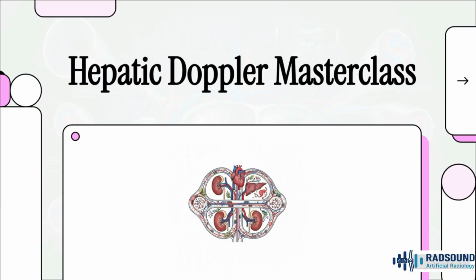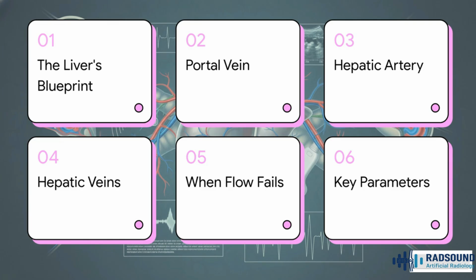Today, we're going to journey deep in. All right, here's our game plan. First, we'll look at the liver's vascular blueprint. Then, we'll dive into the big. I'll wrap up with the key parameters and pitfalls you need to know. Sound good? Let's get started.